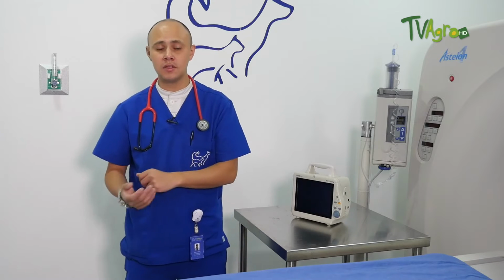Well, as indicated, the patient is under general anesthesia, and the prior requirements for anesthesia are very basic. They are exactly the same as we need for surgery, the most general pre-anesthetic examinations, depending also on the age of the patient. The idea is that patients under 7 years of age enter with the basic general examinations for an anesthesia, and over 7 years of age enter with slightly more specific examinations.